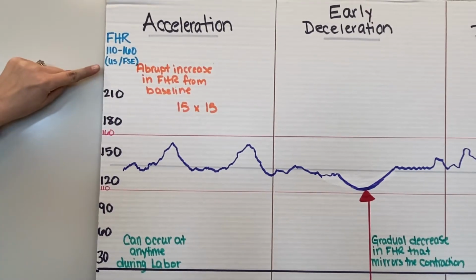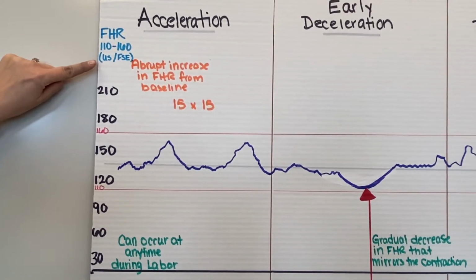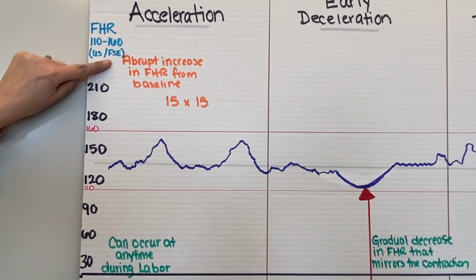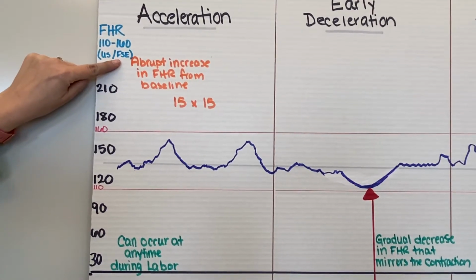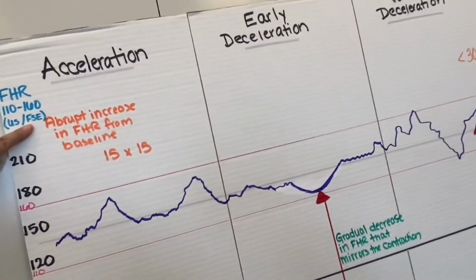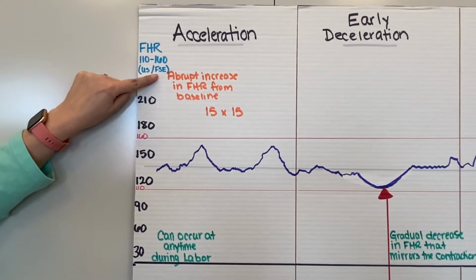We're going to monitor the baby with either an ultrasound. This is the external device that goes on the mother's abdomen, or if we needed to measure internally, we could put what is called a fetal scalp electrode, which is also abbreviated as FSE. The mother's water has to be broken for this. And we screw the little piece onto the baby's head, and it's basically like a continuous EKG of the baby.